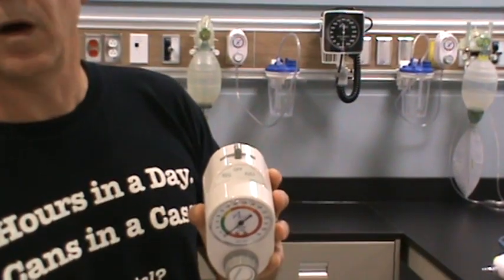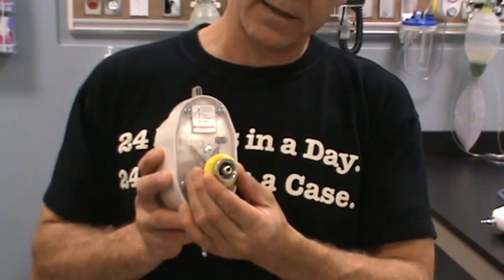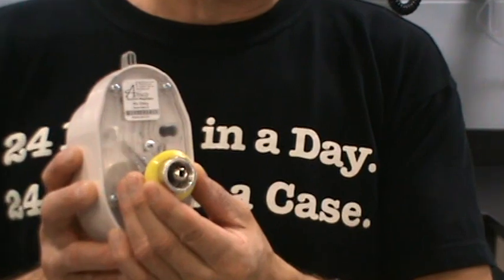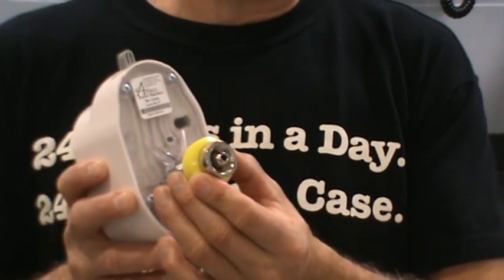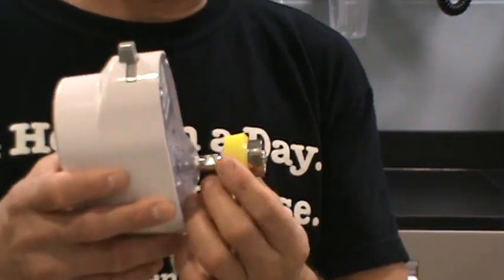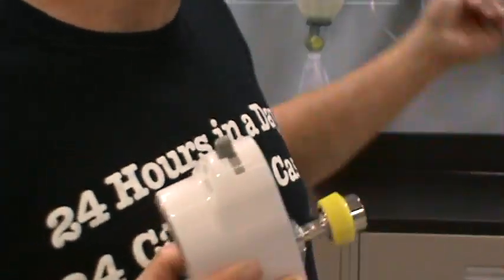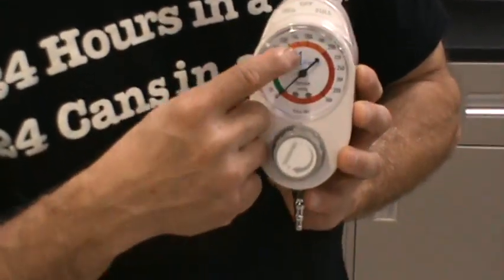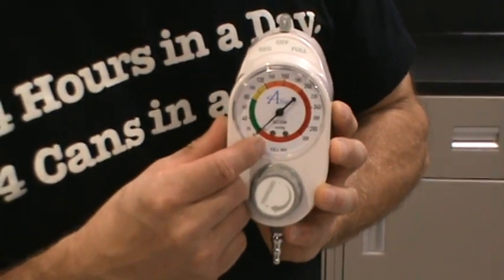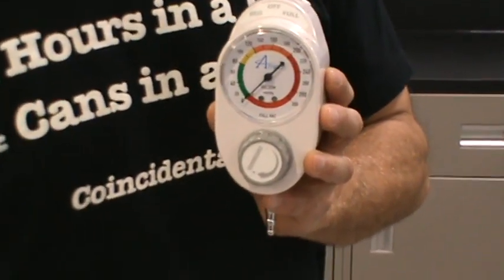If we could just get a zoom in on that. Now, if you look at the regulator, there are a few basic features you need to be aware of. Looking at the back, it's got a diameter index safety system fitting — called a DISS fitting. You need to secure this to the wall outlet by matching it up to the appropriate station outlet and turning the knob to the right. That will attach it firmly. On the front, it's got a gauge that tells us how much negative pressure is being applied back to the patient.